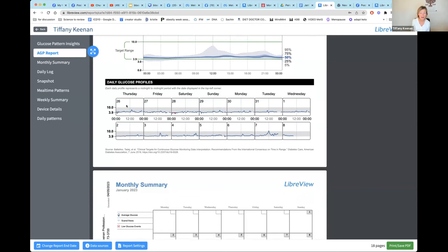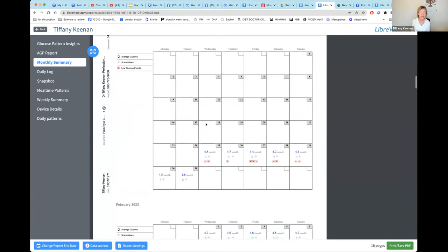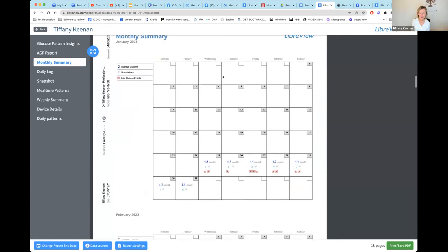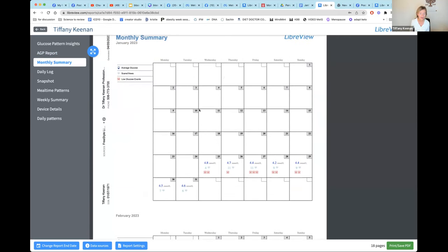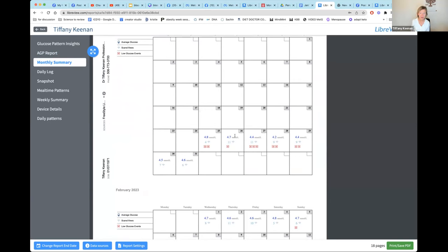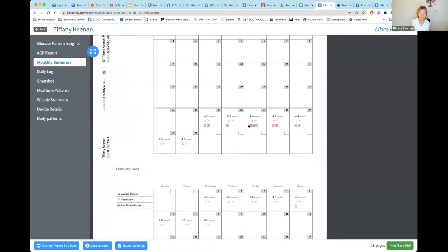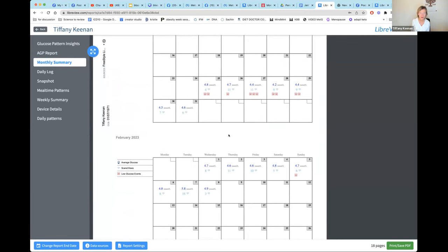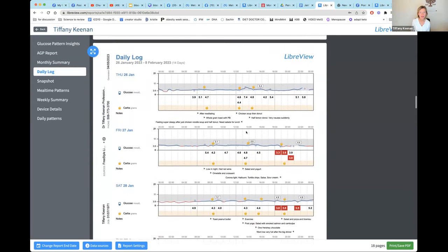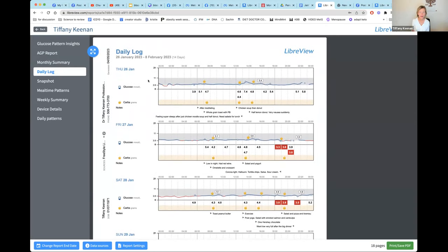If you plug this in tonight or tomorrow you'll see three days of data and it keeps uploading daily. As a physician I quickly look at the overview, but what I really want is the detailed daily data. There's a monthly summary screen — for diabetics this is important because it shows your average sugar for the day, your highs, and little red arrows indicate lows.